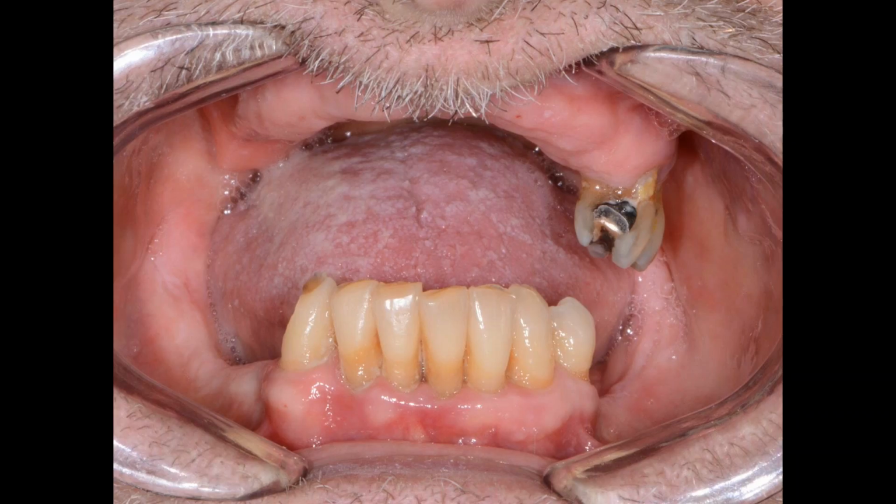So he said, if we're going to convert you into dentures, then the minimum that we want to do, at least on the bottom, is to get you 2 implants with some type of attachment. In this case, we use the locator attachment, or you can use an O-ball attachment to provide an overdenture in the lower arch.